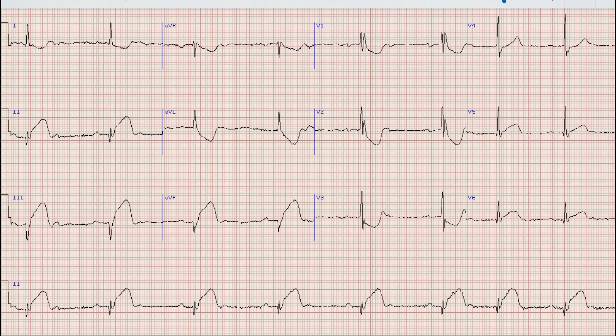As you all know, the first thing we look at in an ECG is the rhythm. For rhythm we will look at lead 2 or the rhythm strip. As you can see, there are upright and prominent P-waves before each QRS complex. This means that the rhythm in this ECG is sinus.